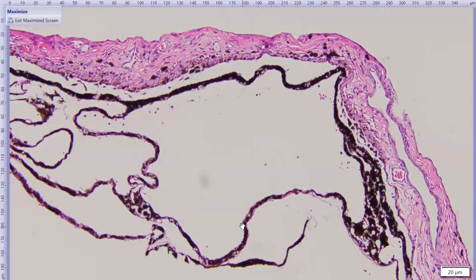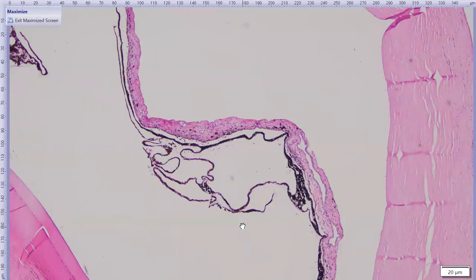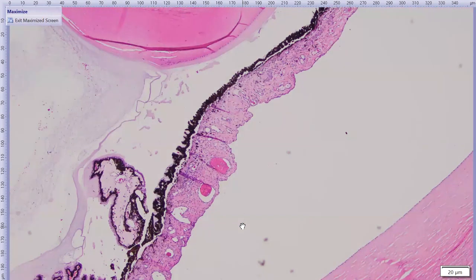Because here they're definitely behind the iris, but do they project through the pupillary space at all, Megan? They do. They sort of peek around the end. It's more obvious in the gross photo. Exactly. The way they sort of peek around the end, projected through the pupillary space. Mm-hmm. So I guess the combination of the thinning and stretching of the iris and the presence of the pigmented cysts behind that likely caused a darkened appearance of the iris.